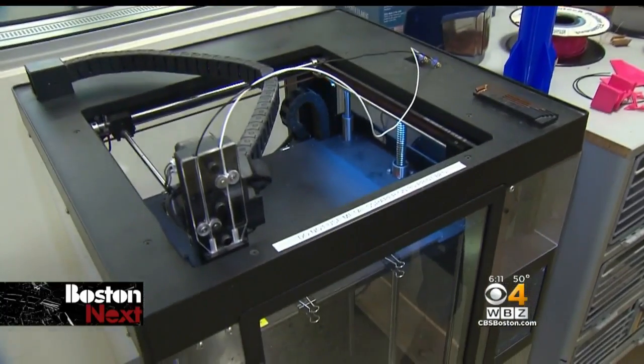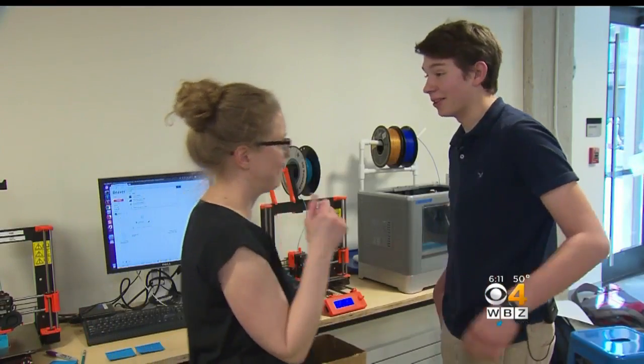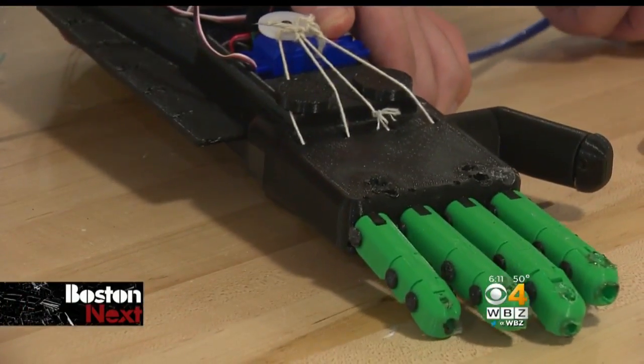It just so happens that here at Beaver Country Day, they have five 3D printing machines. We do our best to make sure that we can make just about anything here in at least one way. He works really hard, and it's really fun to watch him. His teachers helped him take that design, print the pieces, and create a hand.